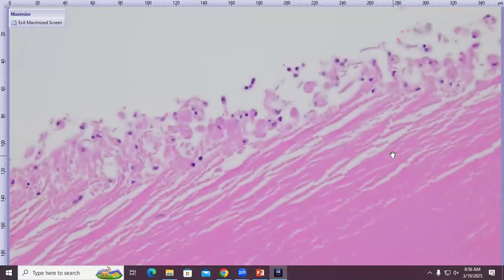We have all these adorable macrophages lining the exposed ends of the lens fibers and phagocytizing them. In Coplow, we call this phaco spaghetti. That's not a scientific term, as you might have guessed. But it's a fun term. So, yes, manuscript pending. No, not really.